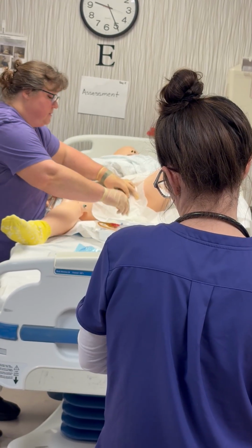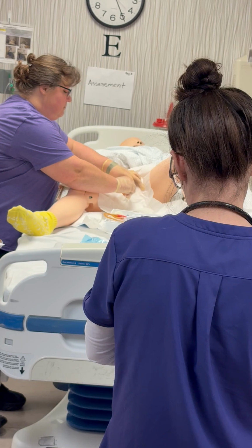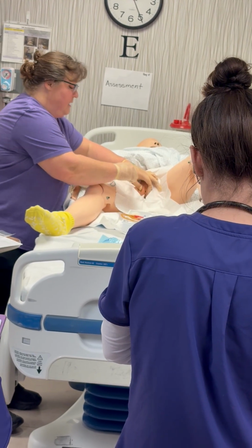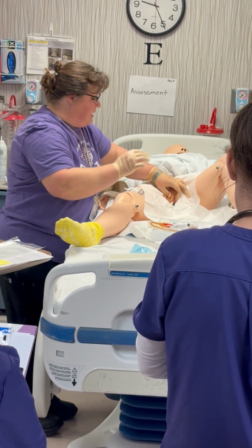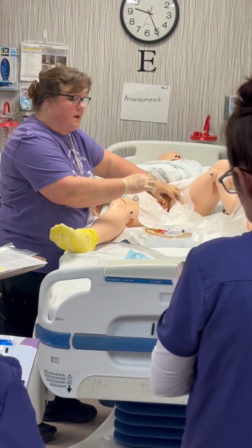Out and around. And then my third one is straight down the middle, okay? Making sure you get that urinary meatus. And then out and around. All right, keep this open, don't let go, gotta keep it open, okay?